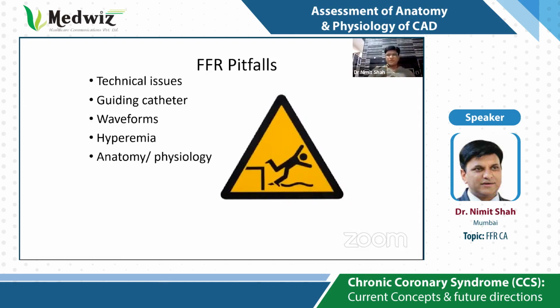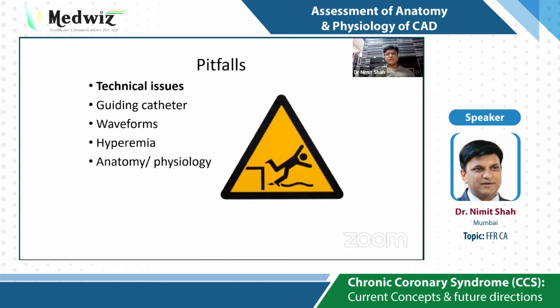What are the pitfalls? Because FFR, if you do it haphazardly, if you're not trained, you've not gone through the training, you might end up with false positive and false negative results. So I would cover technical issues with the guiding catheter, identifying the false waveforms, how to achieve hyperemia, and anatomy and physiology. So, technical issues.